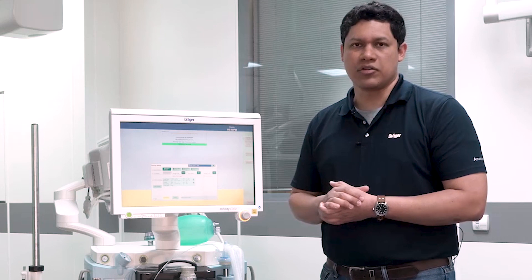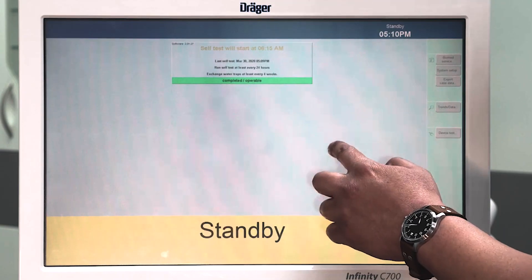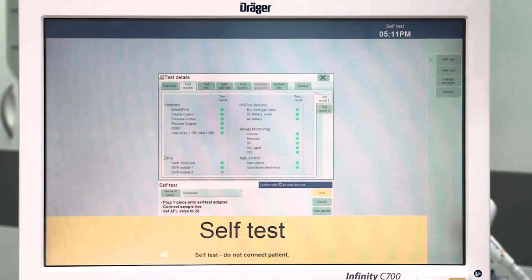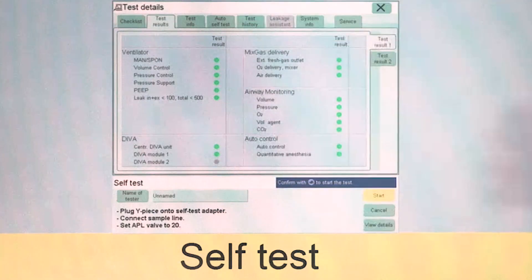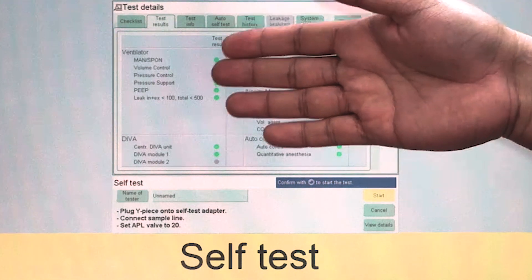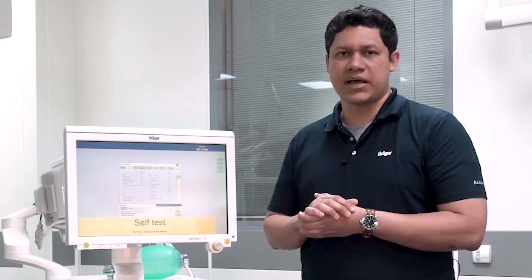If you need to verify on the details of the performed self-test, you can close the dialog and go to the device test. Here you can see on the tab labeled 'test results' all the different internal components that have been tested. You will see the color green in all the different elements, meaning that all of them have passed the test and the device is fully operable.